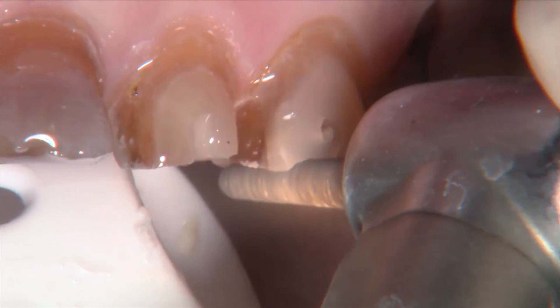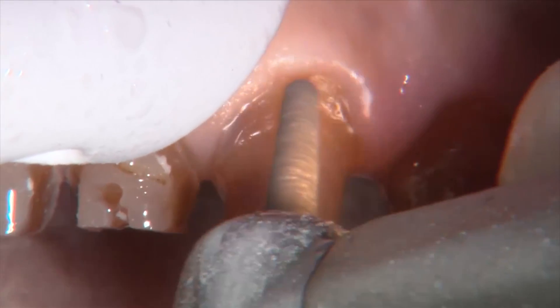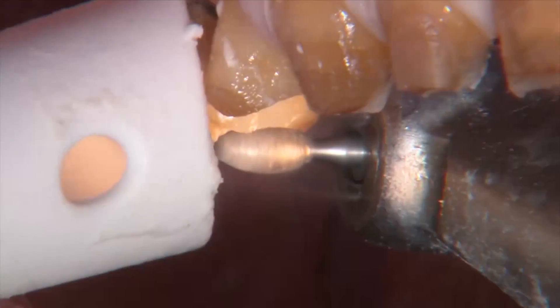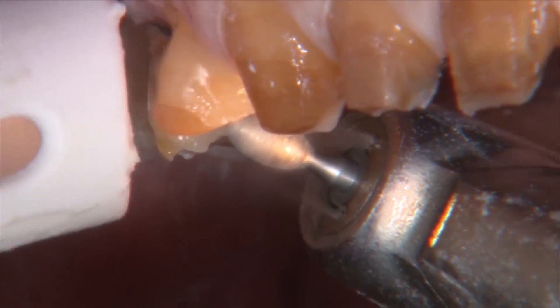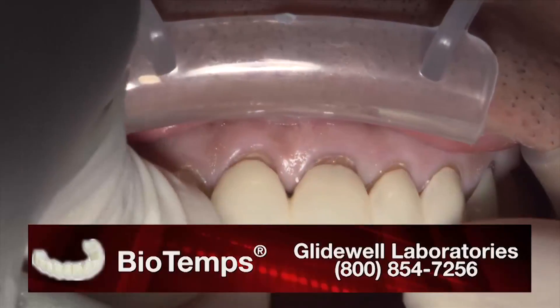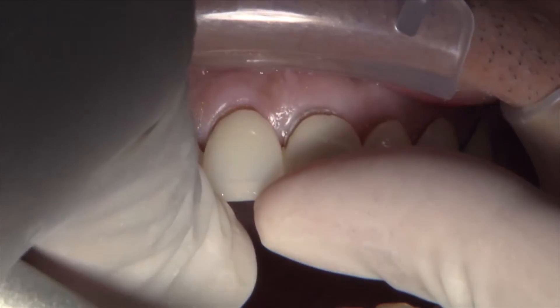Look at how the enamel is still translucent and the dentin is where all the tetracycline staining takes place — it's not in the enamel itself. So when we used to try these cases with veneers, the more we prepped into the enamel to try to give us a thicker veneer, the more the color of the dentin showed through. It was a vicious cycle — prepping into the tooth, noticing it's getting darker, needing a thicker veneer. We've had patients where we tried that before and it really didn't work.